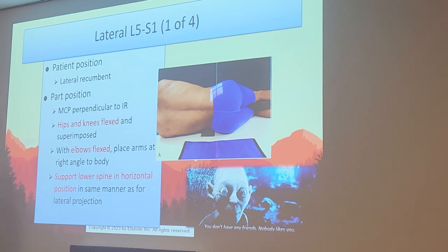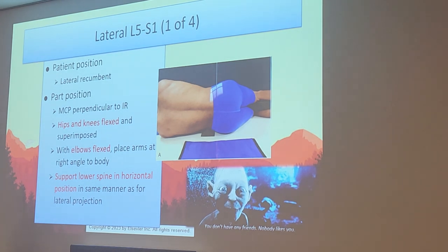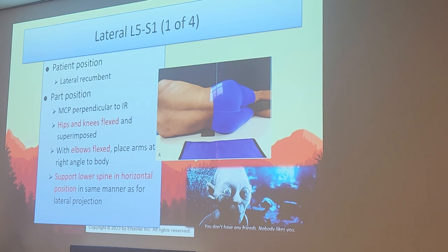So the position for this one is actually exactly the same as a lateral L-spine. We're just going to center in a different area. Most of the time, we'll show you some variances, but we're going to focus on that angulation, that caudad angle of the tube, to open up that joint space further. There are some little variances there, and we'll show you in a second.